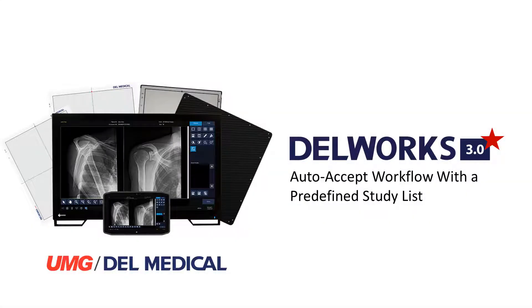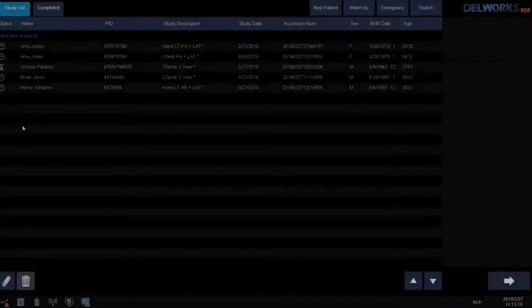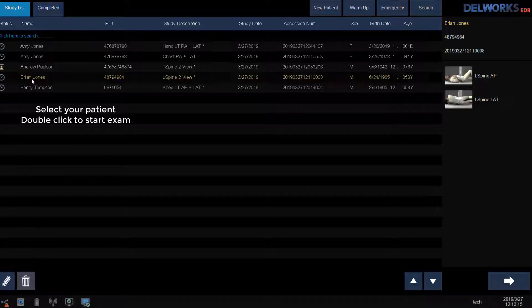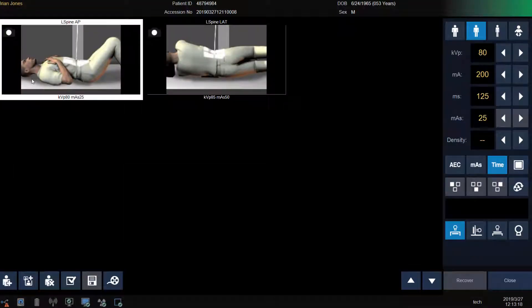I will describe how to start a patient if you have a modality worklist or predefined study list. If your facility has a modality worklist and the application specialist has mapped the exams to your procedure codes, all you have to do is double click on the patient's name to start the exam.